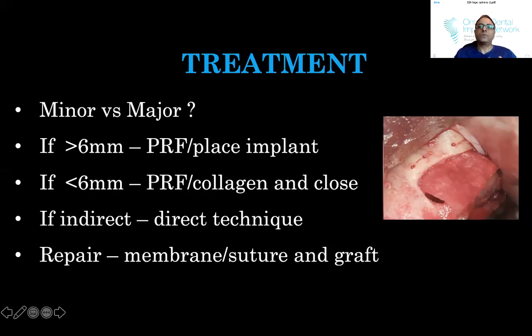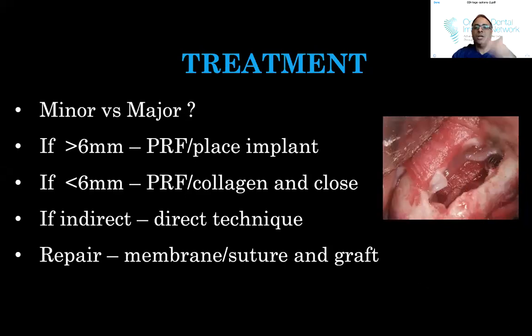Okay, so we've gone ahead and we've created 2 holes. If you can see that, we've got 2 holes on each side of the window, and then we're suturing the membrane to those holes. And I can tell you it's not easy to do that. This is a 30 by 40 membrane, so it's huge. It actually invaginates into the membrane, creating a new floor.